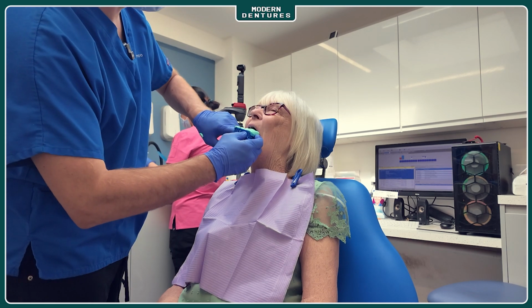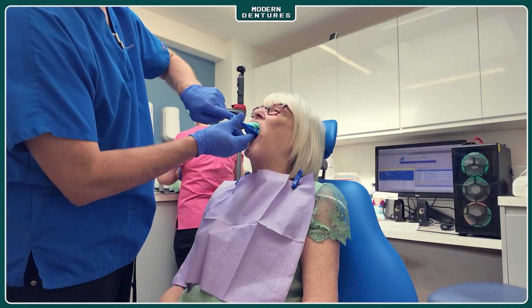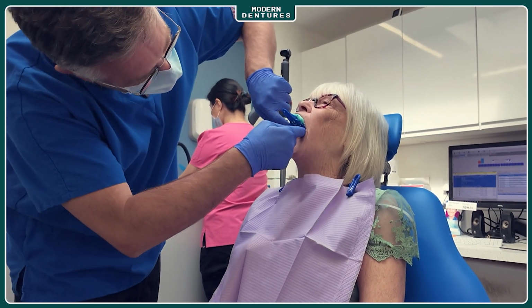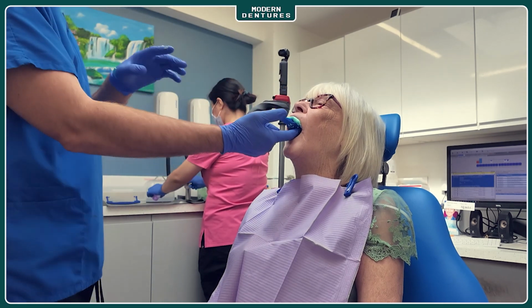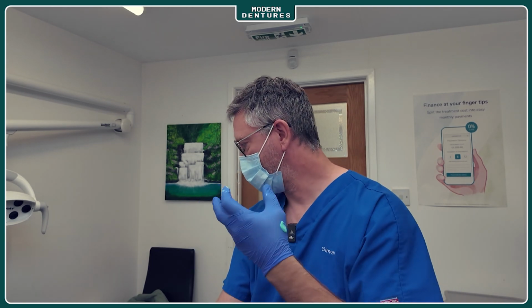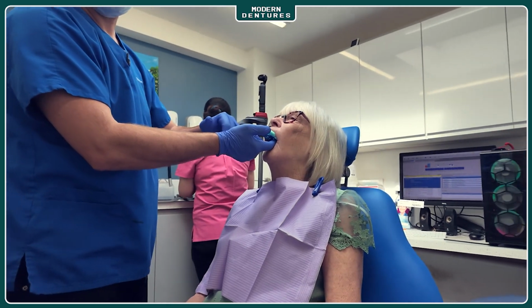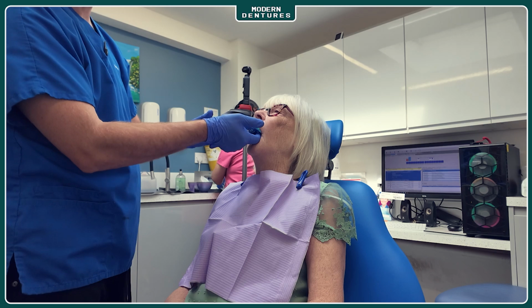So relax your lips for me. There we go. Keep your lips nice and relaxed. We tilt it up at the front first, and then looking to see when the alginate's coming out, we slowly tip it back. So you can see the alginate coming out the back of the tray. As soon as it does and it comes out a little bit, then you just stop tipping it. This way, what we're doing is we're trying to get as much alginate up the front as we can, so that it's pushing this lip out.